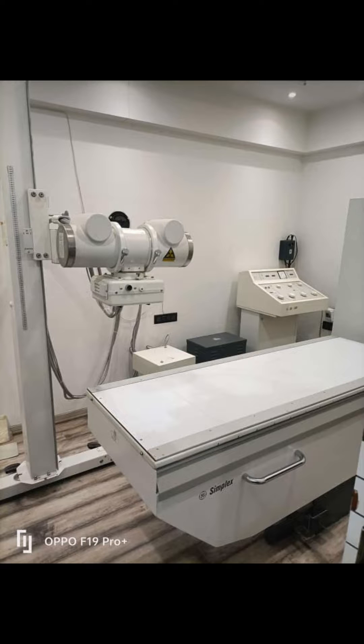Power supply: 3-phase, 400 to 440 volt AC. Capacity: 50 kVA with separate earthing.